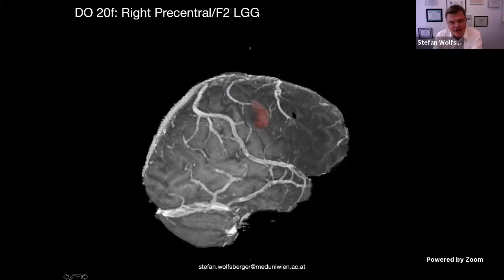So look at this picture now. It's a 3D anatomy picture of your brain surface. Here's the tumor. The tumor is from T2. And here is the precentral gyrus. And the precentral gyrus is what we usually derive from tractography, from the corticospinal tract.